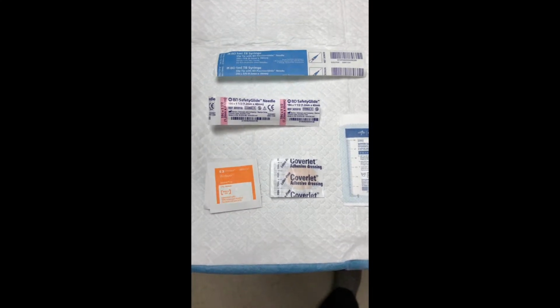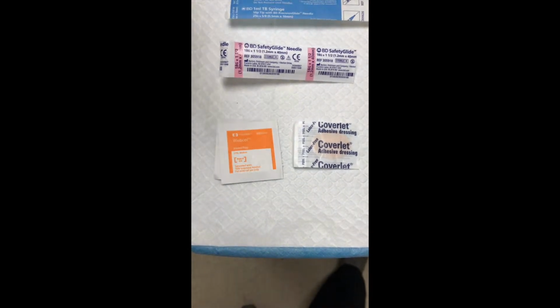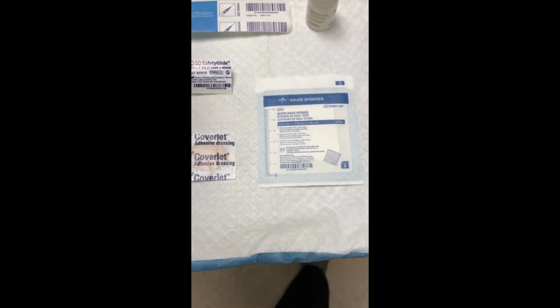Other things that you won't be getting from the pharmacy, but you probably will need, are alcohol swabs, which you can get at your regular pharmacy or even at the Kaiser Pharmacy. They sell that over the counter. Some Band-Aids, and then if you want, some gauze in case you have some bleeding, but that's more optional.